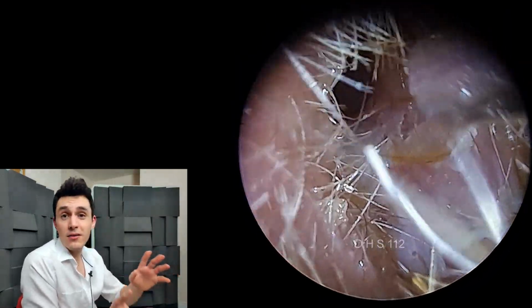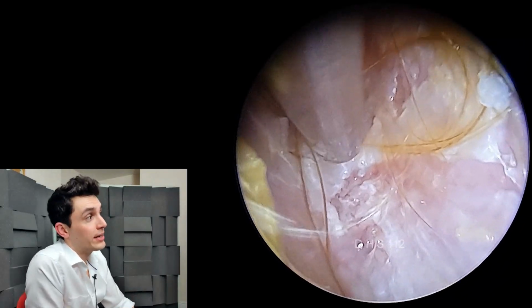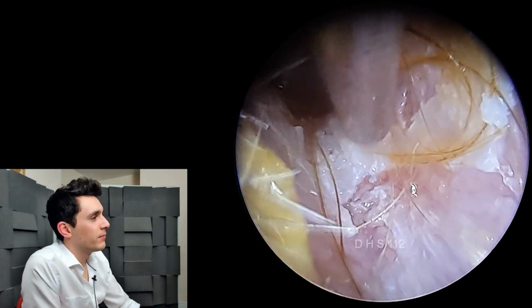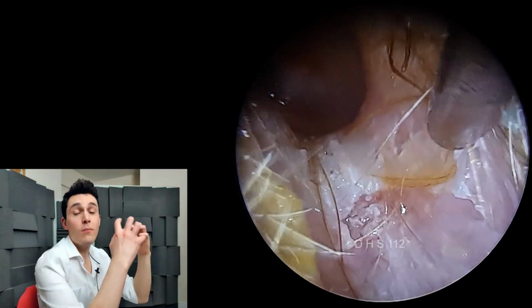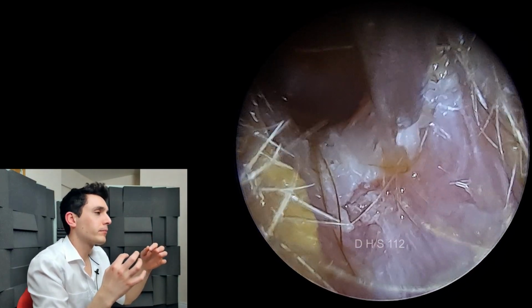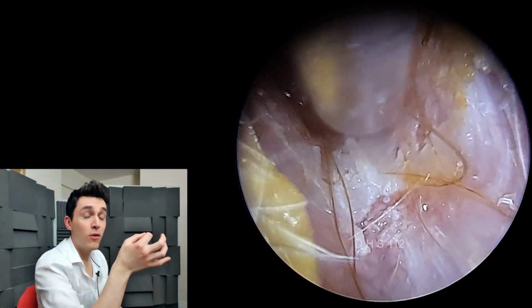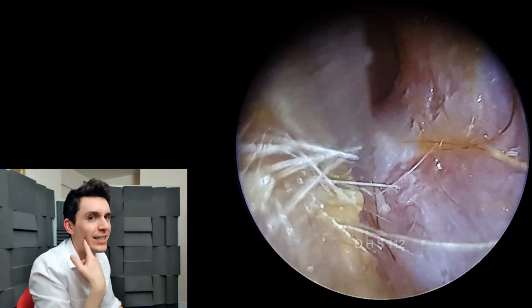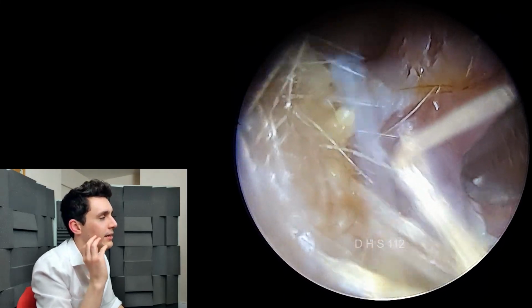It's risk versus reward, right? So you want to peel away as much as you can, but you don't want to create any breaks in the skin. And right around here, I think this is probably where I finished the procedure. I've got both my hands resting on the patient's head, and with my left hand that's holding the endoscope, I've deliberately got my hand resting on his cheek so that I can feel when he's clenching a little bit, so I can feel the muscles in his face. That's quite a common technique.